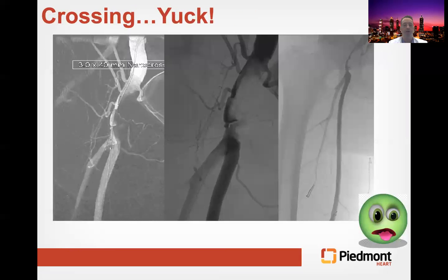It was thought initially that this is fine, we'll just treat this patient with a balloon angioplasty, maybe cut out the dissection flap that's usually present. However, you can see large amounts of debris here in the common femoral all throughout, with a high chance that this was going to embolize. I fell for this, and nowadays I would actually treat this patient with probably catheter-directed therapy.